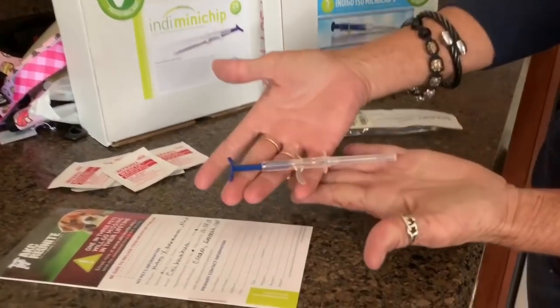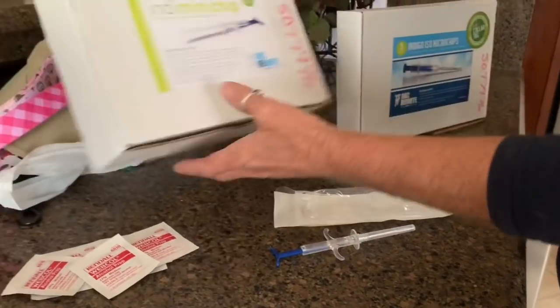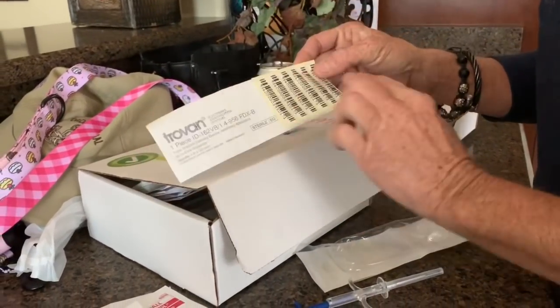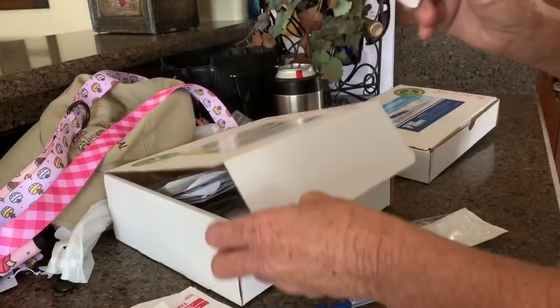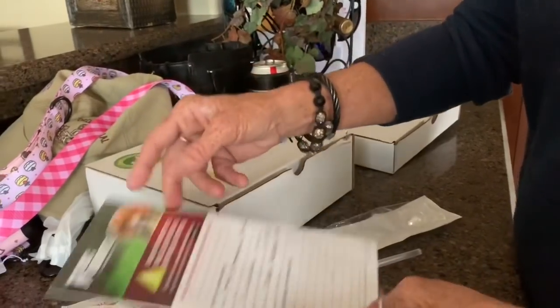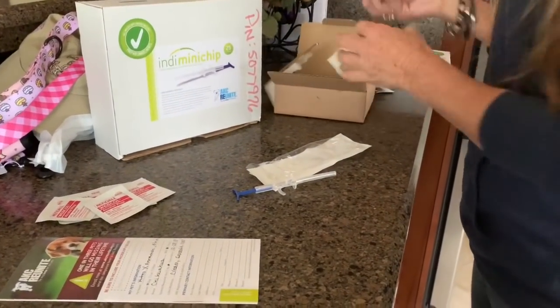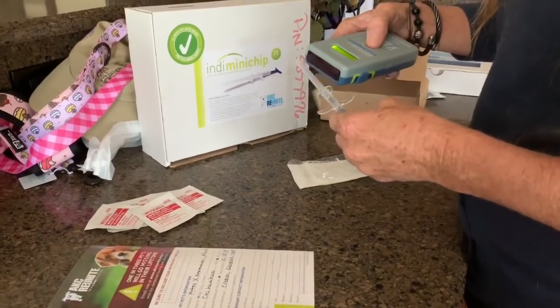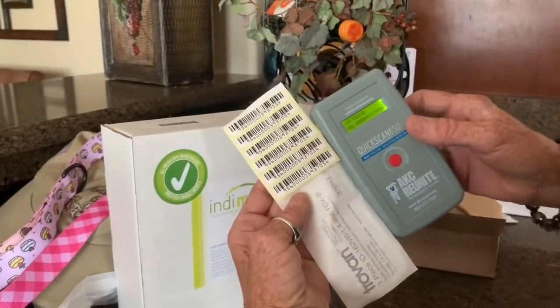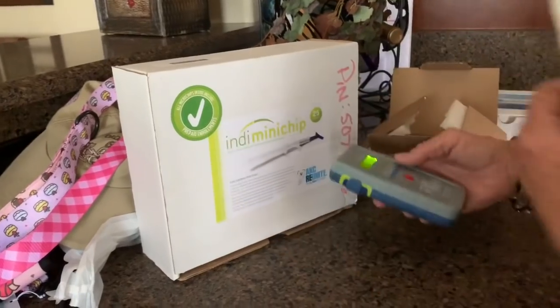This is the chip itself — it's in the needle. This is how we get it in the puppy. It comes in the package, sealed and sterile, and you have your microchip number that matches the microchip that is in there. We have the pamphlet that comes with this, which allows the owner to register the chip once they get the puppy home. We have the reader, and we use this while we're microchipping to make sure that the chip in the needle — the microchip number that comes out — actually matches the numbers on the UPC code. We have to make sure the numbers match on all of them. They do, so that's where we start.